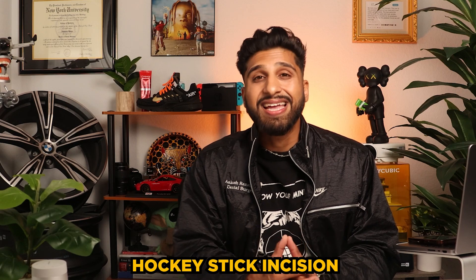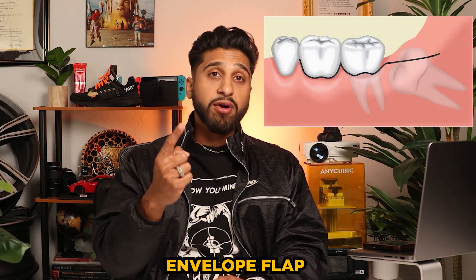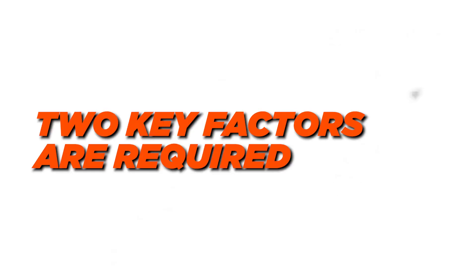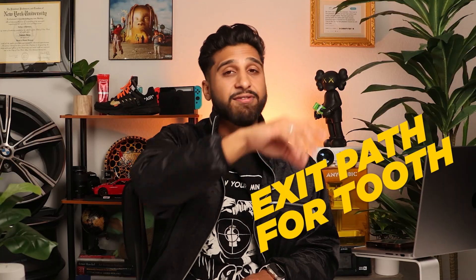We need a clear plan when tackling horizontal impactions. Firstly, I need to create a large flap to gain better access to the impacted tooth. This involves making a hockey stick incision along the buccal surface and extending it towards the distal buccal line angle. Additionally, I create an envelope flap connecting the first and second molars to provide adequate visibility. In this particular case, that tooth is buried, so we have to section it and get it out. Remember, when moving wisdom teeth or any tooth, there are only two factors required: a location to put the elevator in, and an exit path for the tooth to come out.